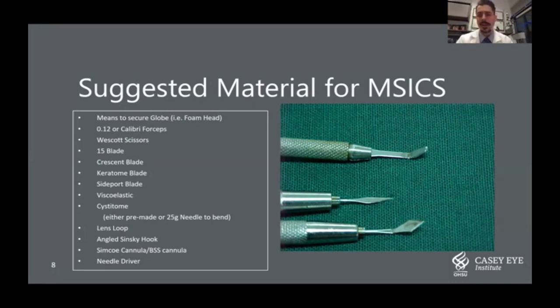I have also used surgical instruments for practice that would later be used on human eyes, which would be frowned on in the United States, but with good sterilization practices, I never had any infections or problems.